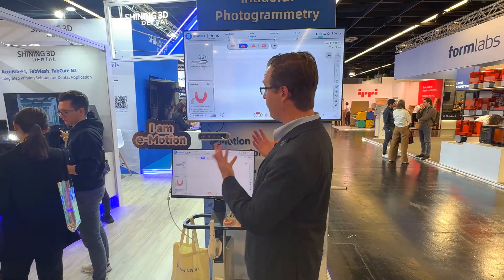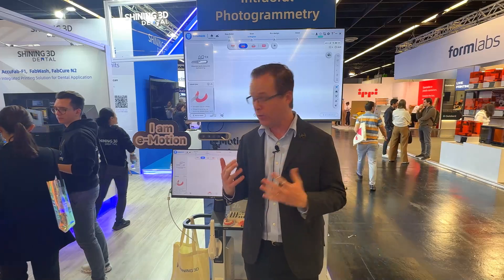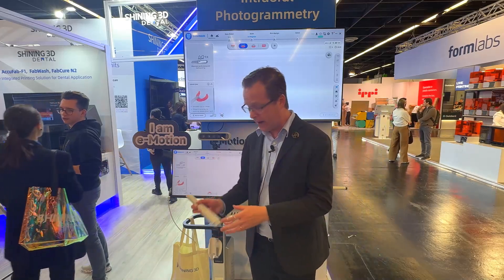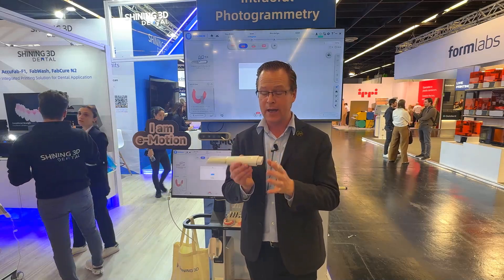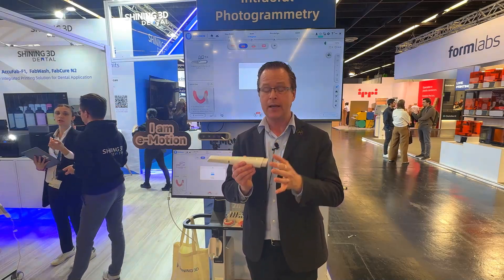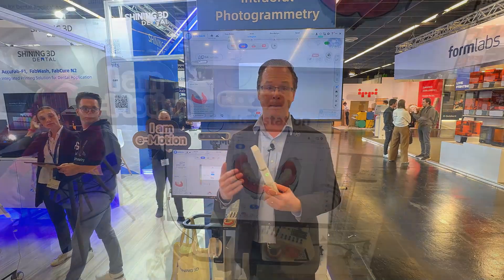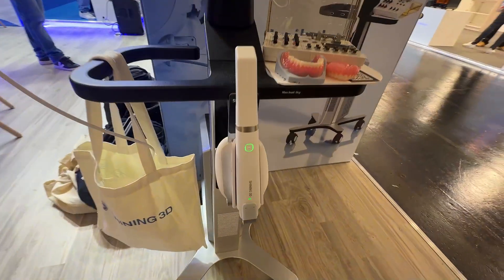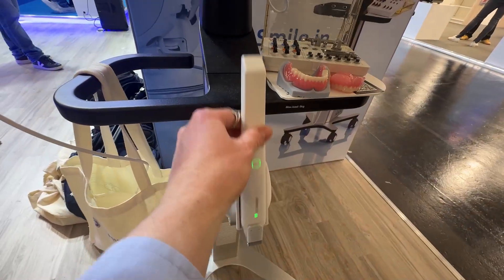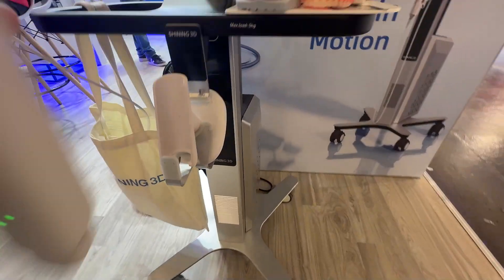First and foremost, I'm in front of the Emotion stand. Most notably, we have the Shining 3D Elite scanner with wireless — it has a battery and replaceable battery using Wi-Fi connection to the computer. That is a carryover of their Shining 3D Elite scanner utilizing the same color-coded scan kit and photogrammetry that we've heard about.